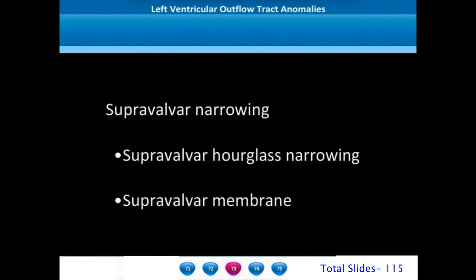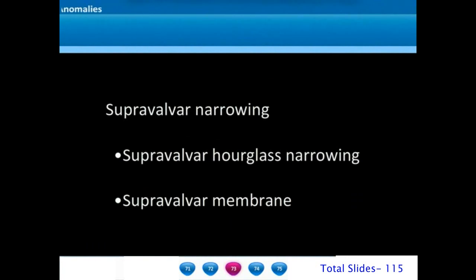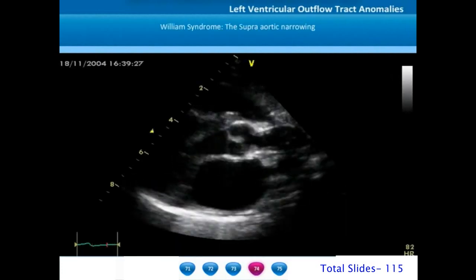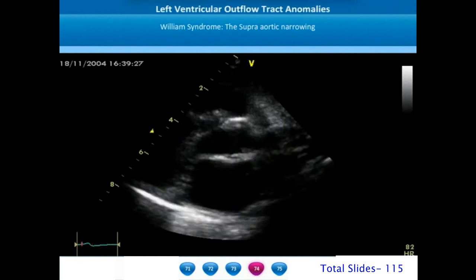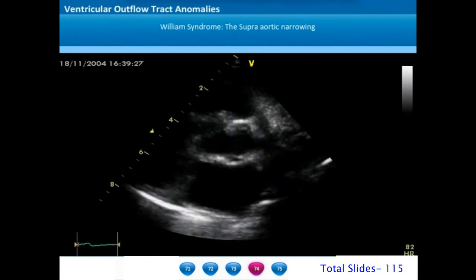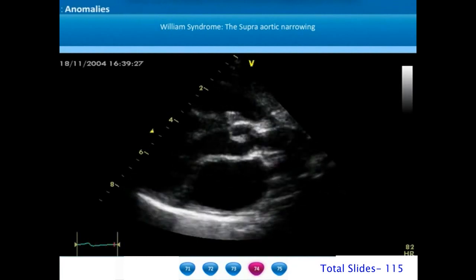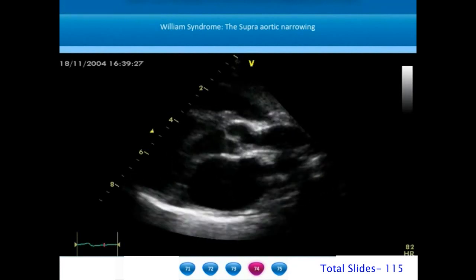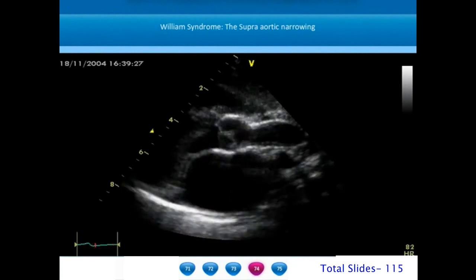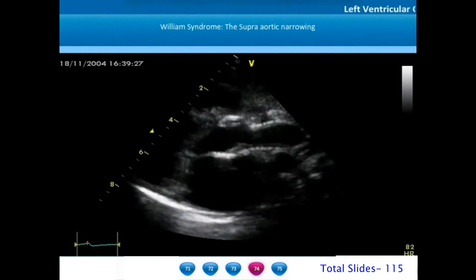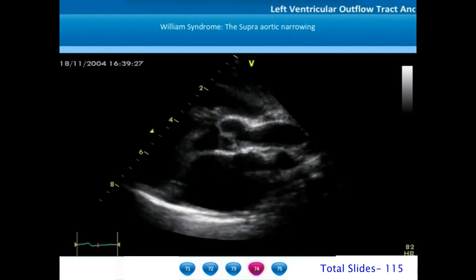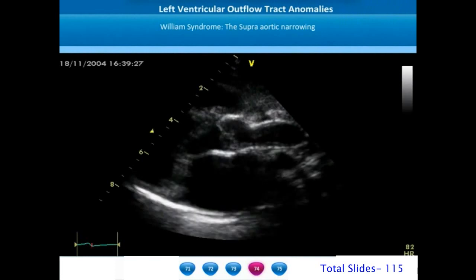Now let us move on to supravalvar narrowing. The supravalvar narrowing is commonly in the form of an hourglass narrowing, though very rarely we may see a supravalvar membrane. This parasternal long axis view shows a typical hourglass narrowing at the sinotubular junction and proximal ascending aorta. The ascending aorta is substantially thick, and during surgery the surgeons have identified this portion of the aorta as extremely thick and sometimes even cartilaginous.